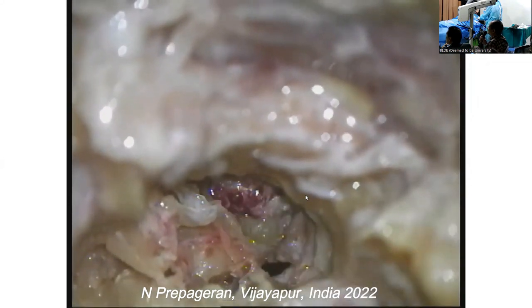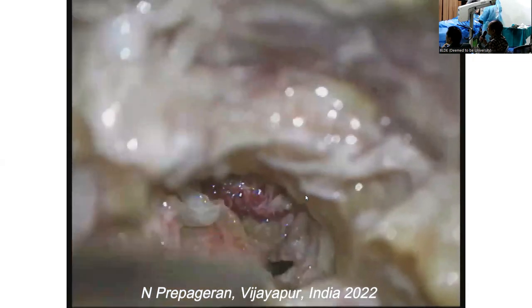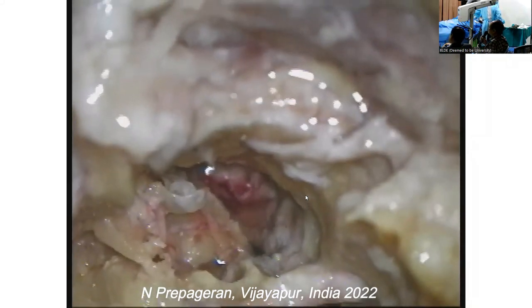That's how difficult it is to injure the artery. Okay? Now we're going to do transcochlear. Clear, guys, so far? Yes, sir. Drill? Excellent, sir.